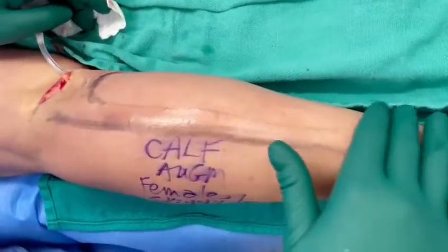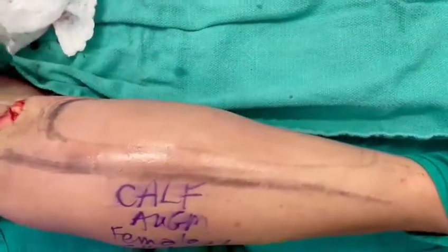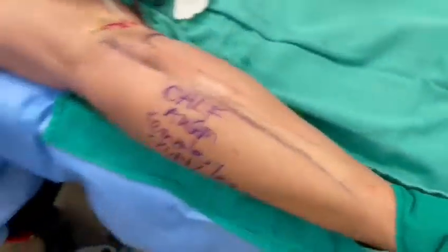See this beautiful inner augmentation — you see no implant, you see no edges, because we're deep into the inner calf compartment. Calf augmentation is a procedure I've been performing for 20 years here in Toronto, Canada. I believe we're the leader in body implants here at the Visage Clinic in Canada.